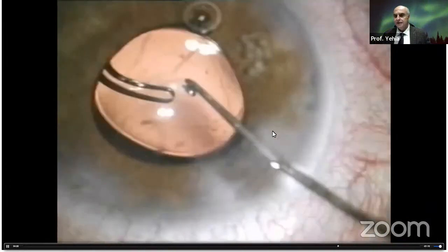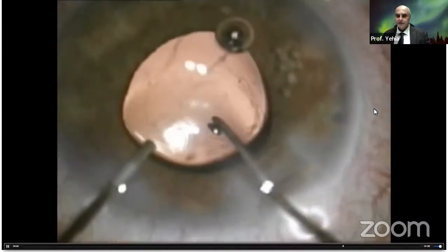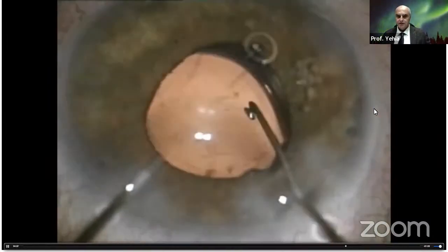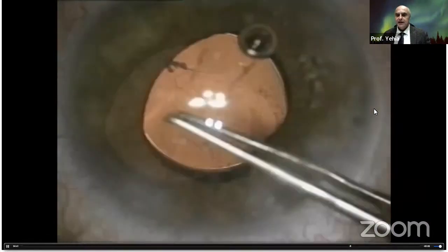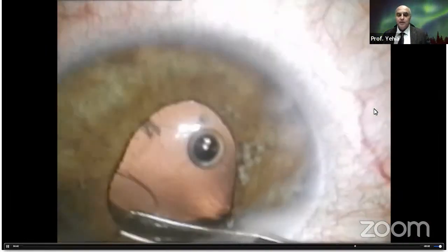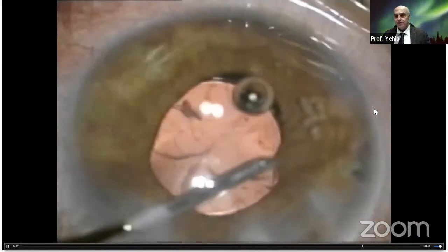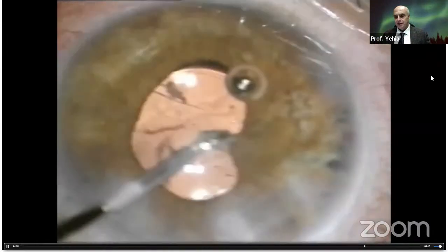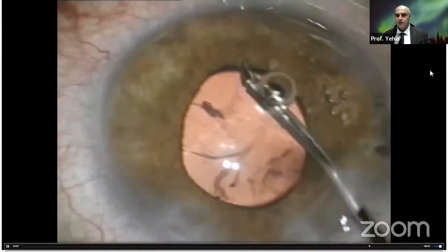You can see here the sites of peripheral iridotomies that was done previously for this patient. Then I'll start to pull the iris, trying to open the angle again, stretch the iris. You have to be careful because you can induce some hyphema. You see, I'm stretching the iris in different points.